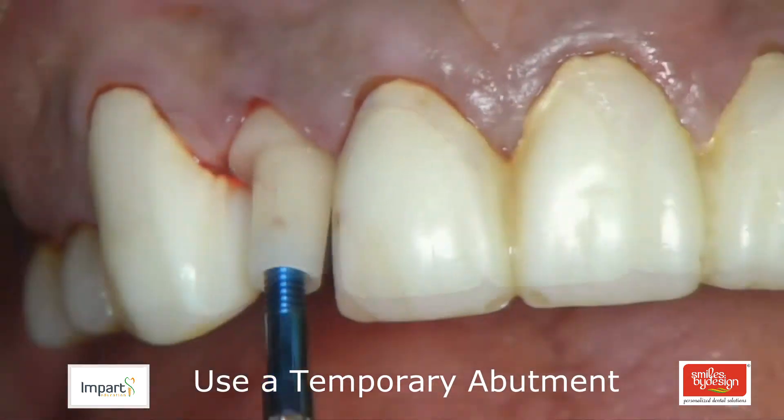Once the putty index is used to carry the material to the mouth and the material sets, when you remove the putty index you will be left with the provisional now adhered to the plastic cylinder. Your goal is to take a small bur, gain access to the screw access hole, and unscrew the entire assembly from within the implant, and then shape the provision in the correct form.